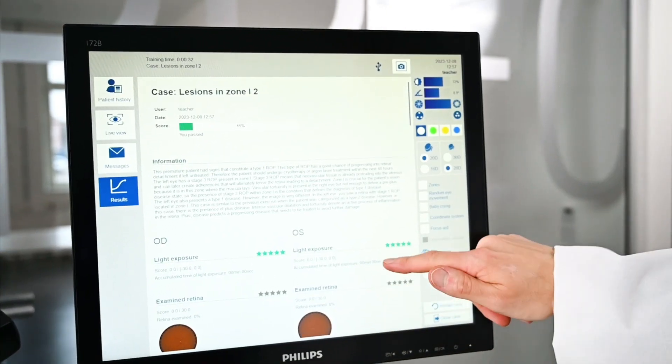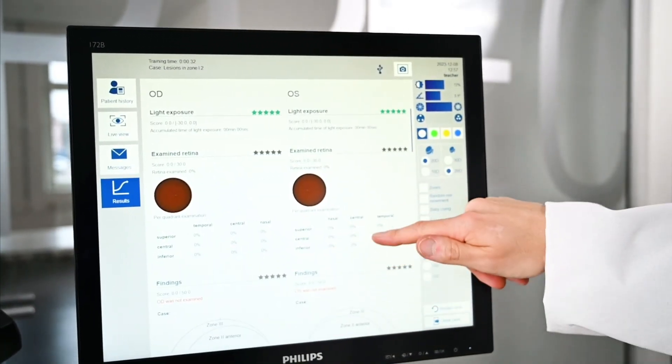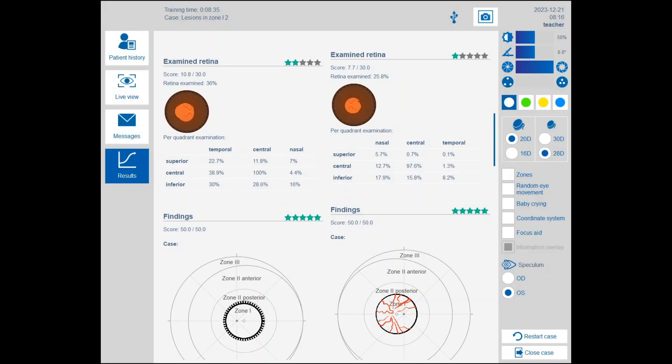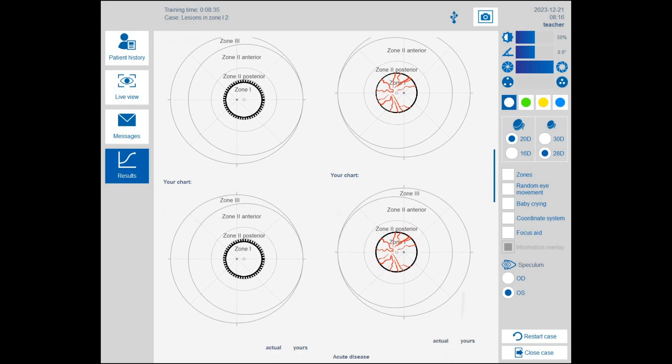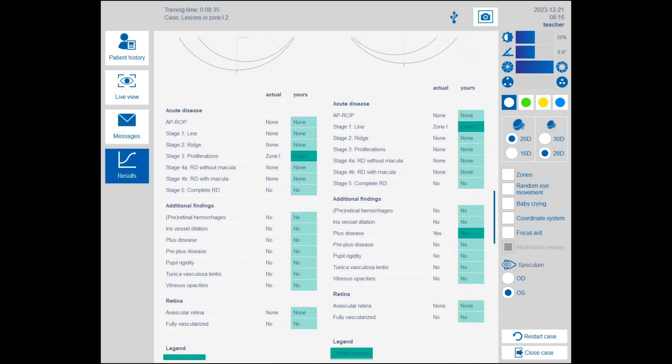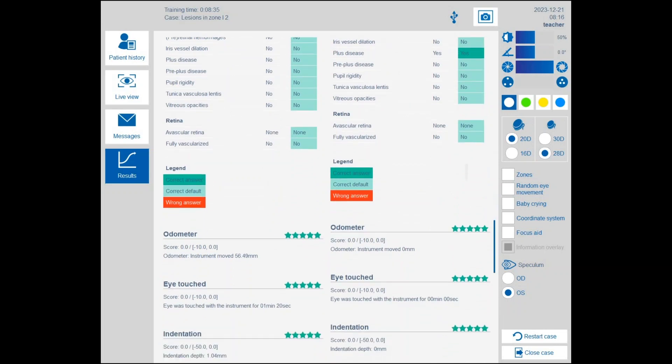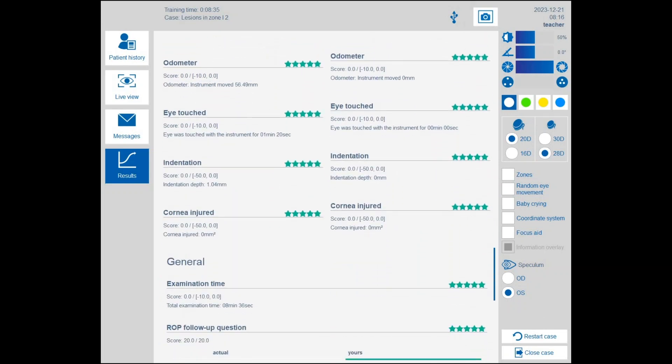After each case, the IC Indirect ROP presents trainees with a detailed performance summary showing, for example, the light exposure, correctness of findings, and appropriate use of indentation. The objective assessment allows trainees to improve their skills systematically.